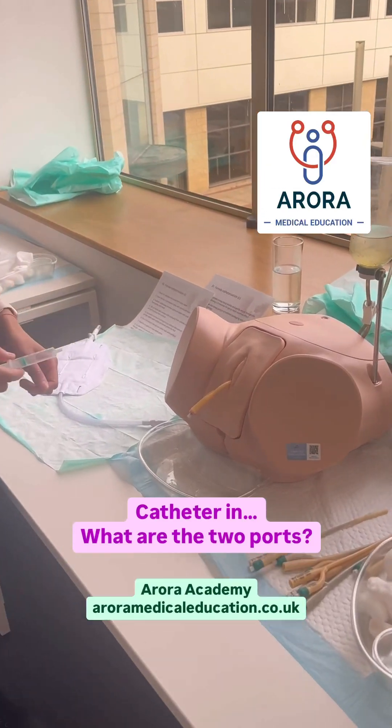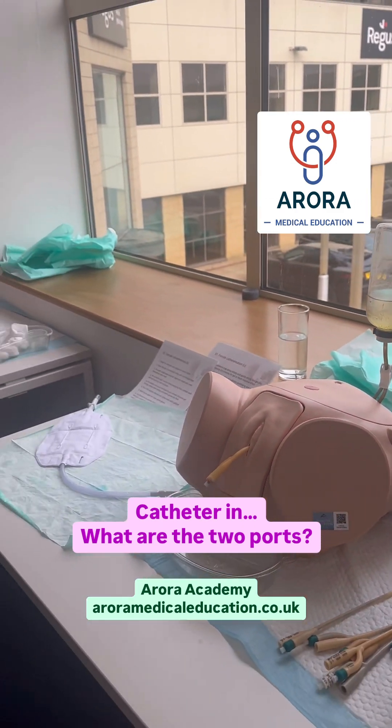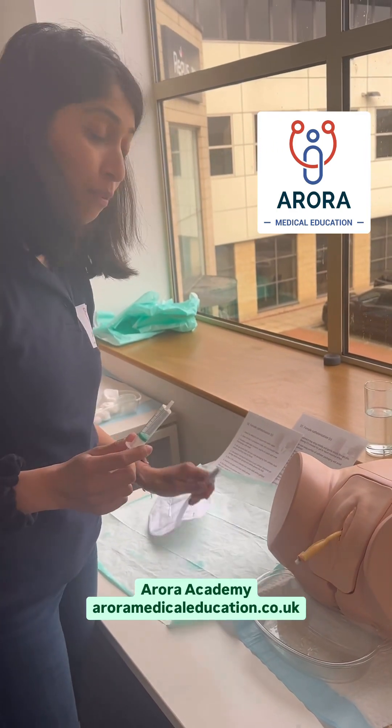So guys, you've just done your catheter, you've got your catheter in place and you've got these two holes here. Let's quickly show you Dr Prank — he's going to show you what these two holes are all about. So this is what people often get confused with. You've got one hole that's for the syringe and then one hole that's for the catheter bag.